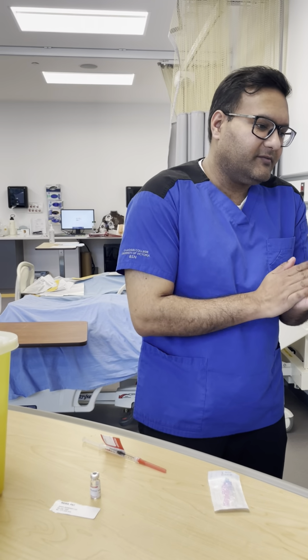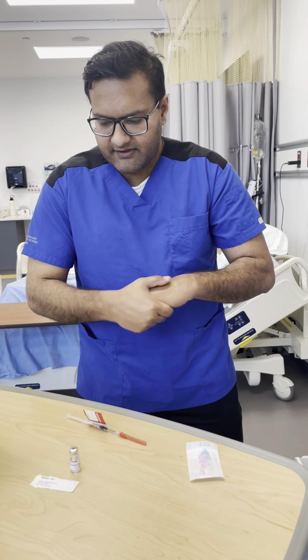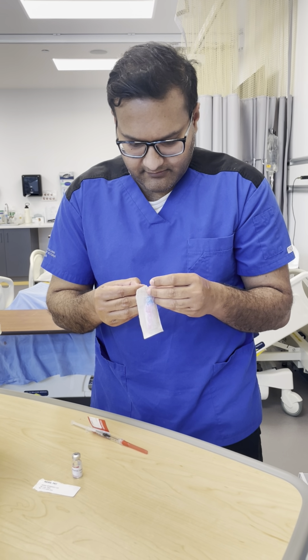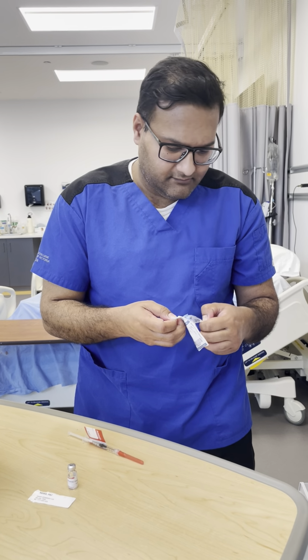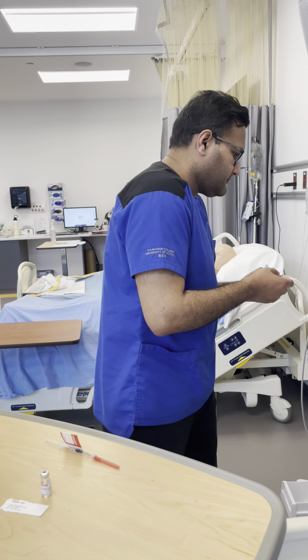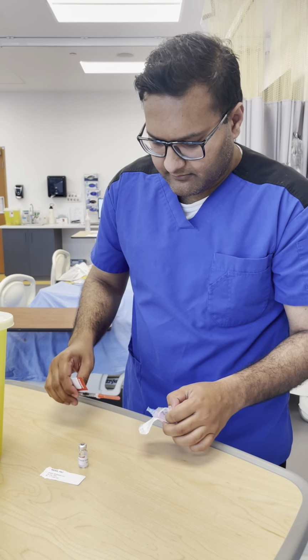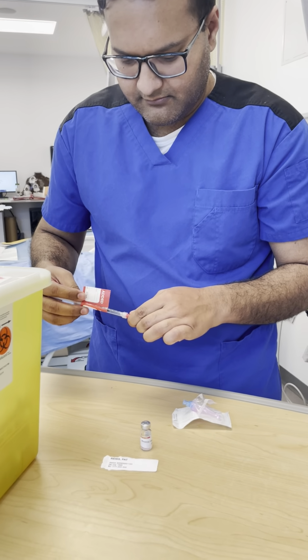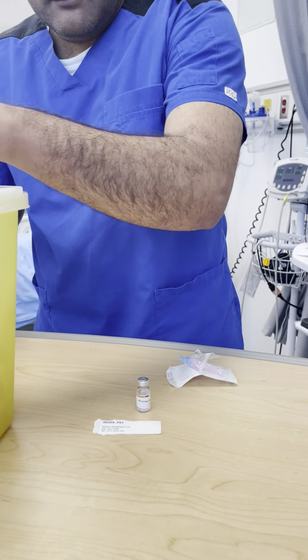And so I will perform another hand hygiene to ensure that sterility and asepsis is maintained. Disposing this into my sharps container as well. Alright, Cal, how do you feel? Feeling alright? Alright, so I'm just going to let you know also, with this medication, you may have some constipation, you may feel a little bit dizzy, you may have some stomach problems. You may be nauseous or feel like vomiting.